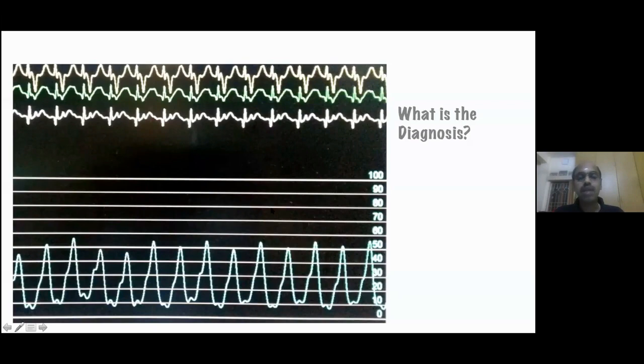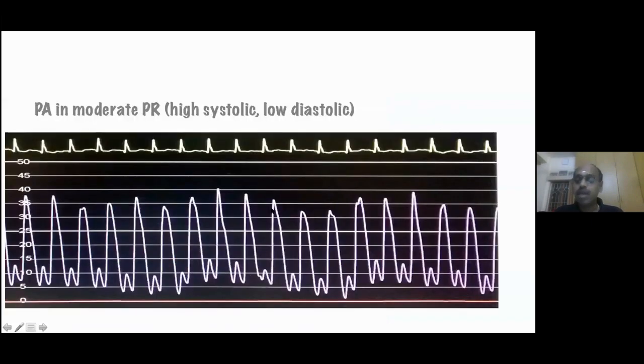So let us come to understanding pulmonary regurgitation. There is another question. In the presence of pulmonary hypertension with normal left ventricular end diastolic pressure, will RA pressure be elevated or decompressed into LA with normal pressure?